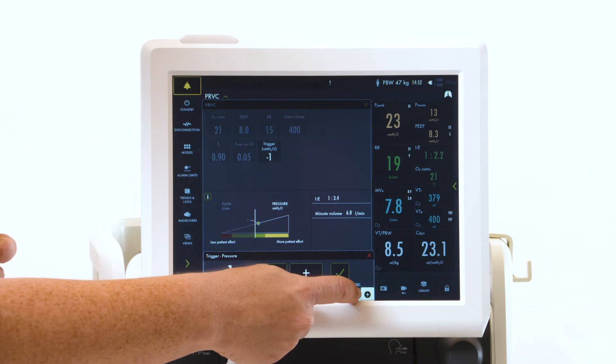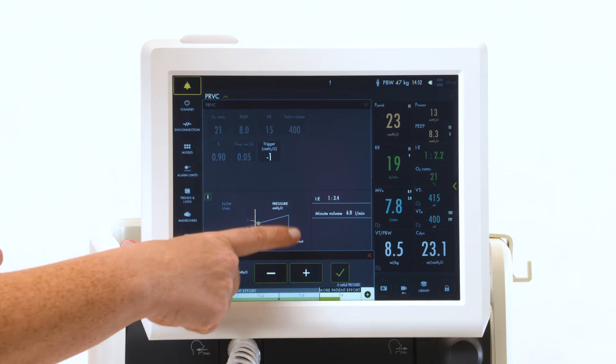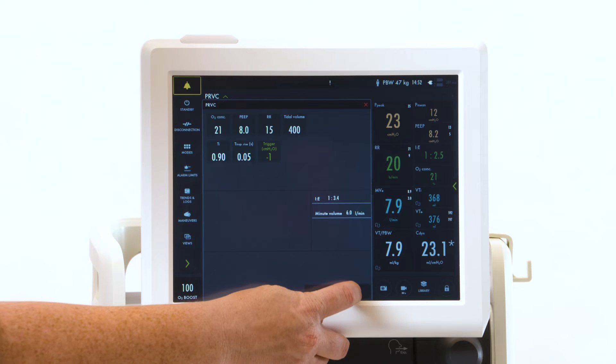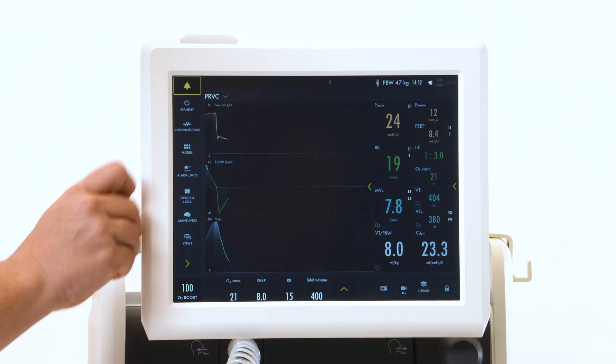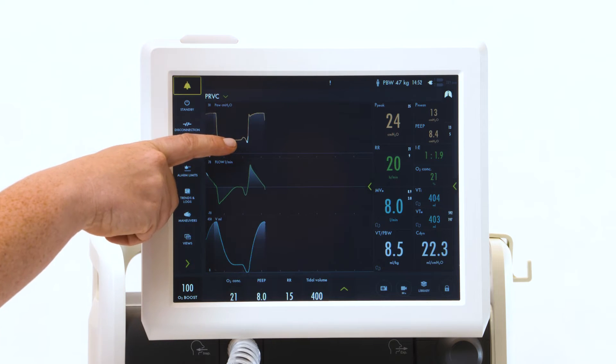Here, you can then slide over to the pressure side, indicating more patient effort, and check mark to confirm. Now, you will see the deflection on the pressure scaler.